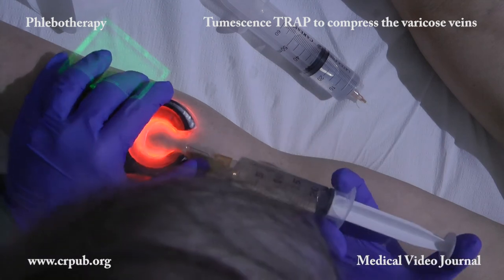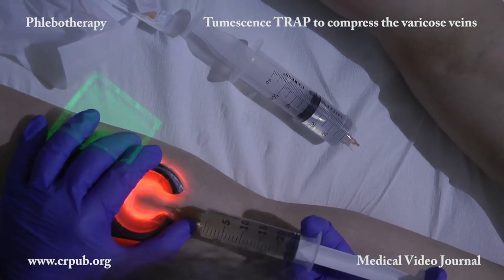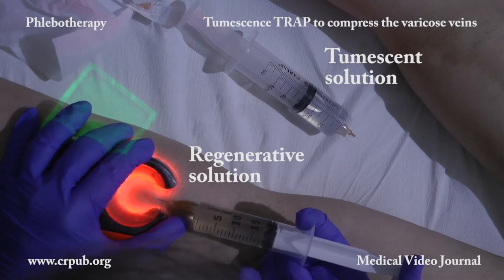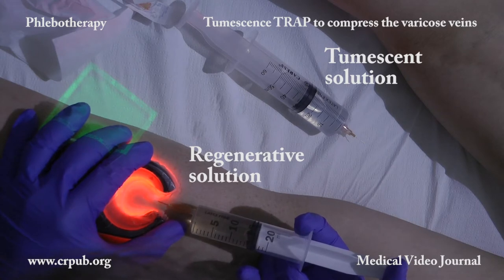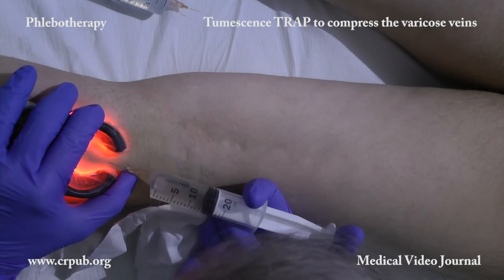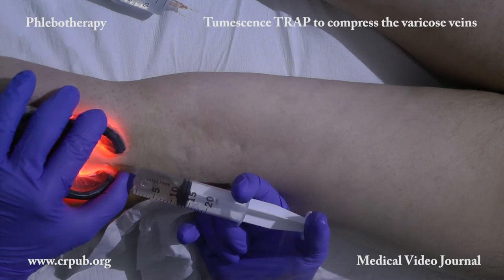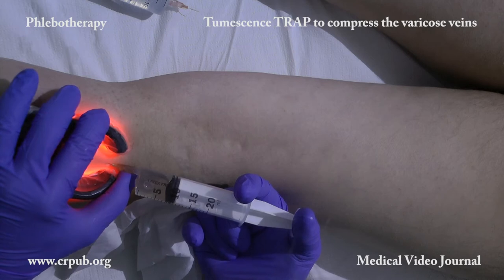In this patient, following three-dimensional regenerative ambulatory phlebotherapy, we will perform tumescence TRAP in order to compress the veins of the popliteal cavity, which are difficult to compress with bandages. As always, TRAP begins from the foot. Transillumination is used to reveal all the vessels, which are injected in sequence. We use a 20ml syringe filled up to 24ml and a 25g needle. During the procedure, the needle is changed several times. In each session, 48ml or 72ml of solution is injected, according to the severity of the pathology and the weight of the patient.